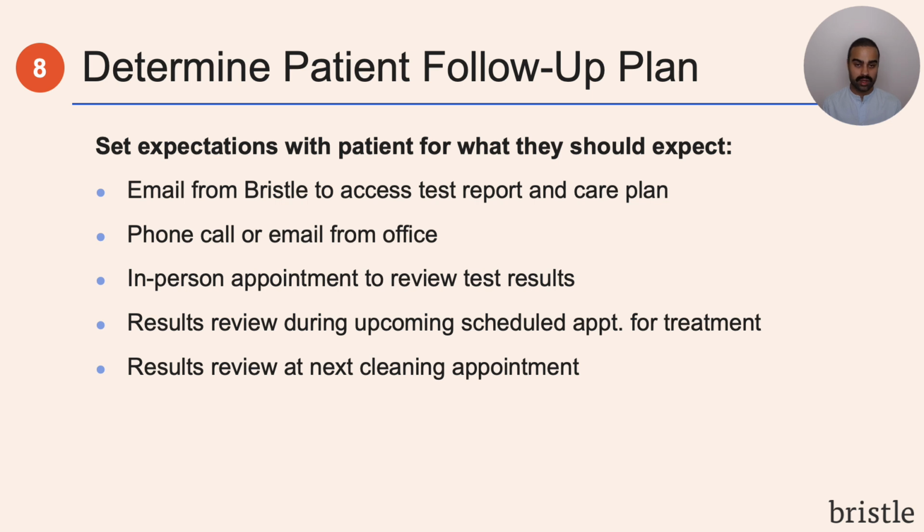So we've collected the sample, we've registered it, we've shipped it back to the lab, but before the patient leaves, it's important to let them know what they can expect next. What is that follow-up going to look like? For each practice, that will differ. It could be an email from Bristle with their results and care plan in 2 to 3 weeks, which is basically you just sharing the Bristle report.